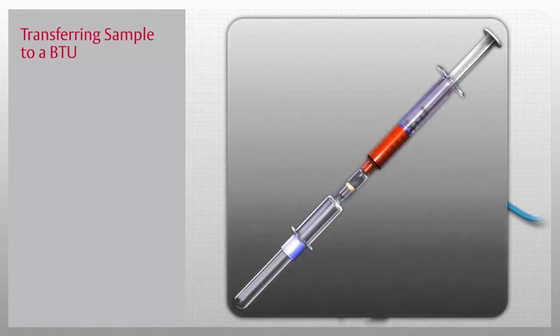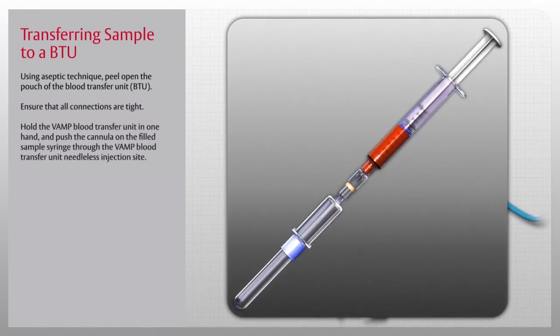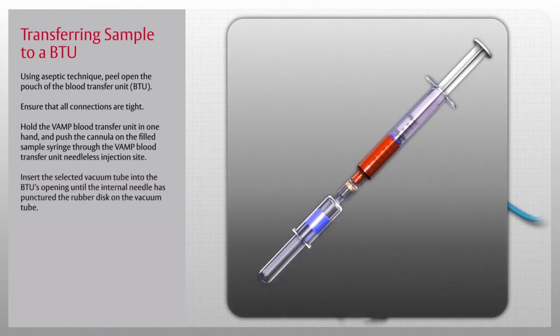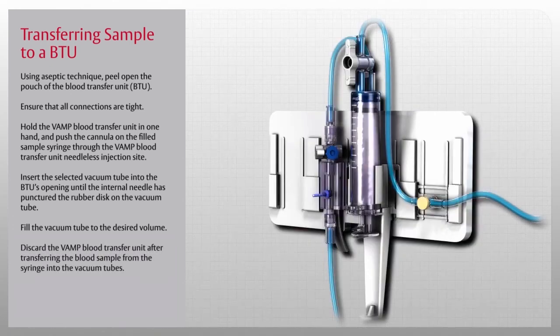To transfer the blood sample from the syringe to vacuum tubes, use the blood transfer unit, or BTU. Using aseptic technique, peel open the pouch and ensure all connections are tight. Hold the VAMP blood transfer unit in one hand and push the cannula on the filled sample syringe through the VAMP BTU needleless injection site. Insert the selected vacuum tube into the BTU's opening until the internal needle has punctured the rubber disc, and fill the vacuum tube to the desired volume. Repeat as needed for additional tubes. Discard the VAMP blood transfer unit, all syringes, and cannulas after use according to hospital policy.